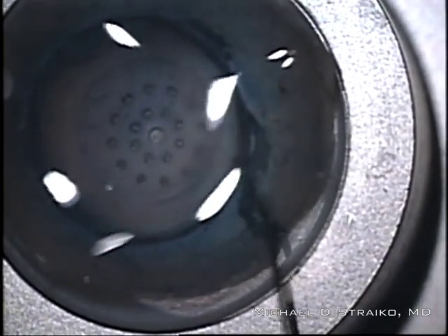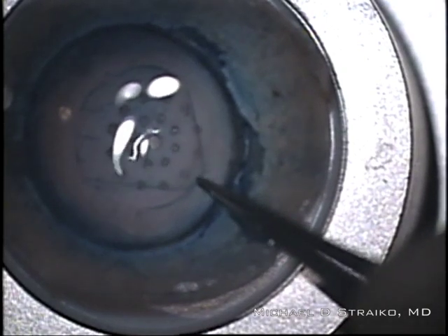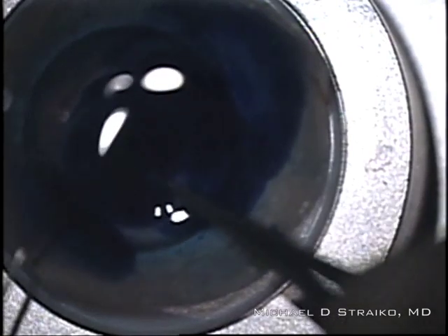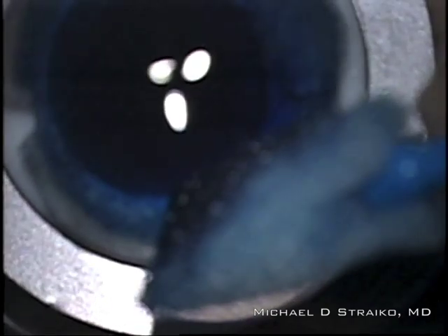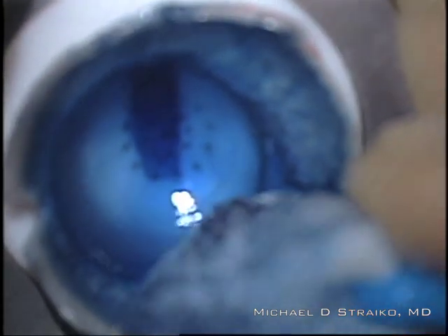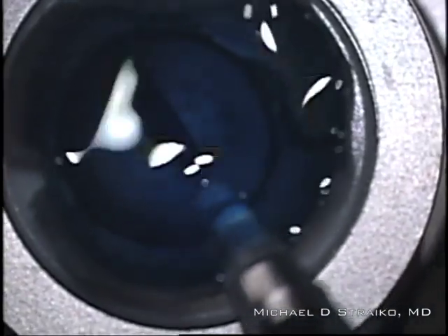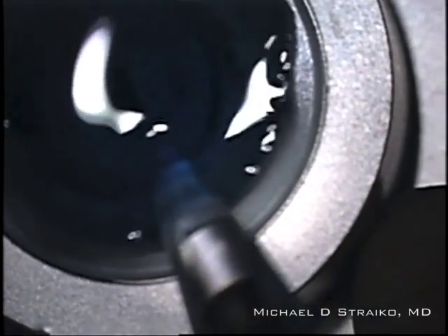I peel off the peripheral Descemet, which can be used for practice on loading the injector. Then I use balanced salt solution with gentle jets of BSS to elevate the graft. Once I have the graft nice and free, I use the tiers to grasp the graft — that's the only time I touch the graft with forceps, just that one pickup. I add Tri-Pan Blue to the well that already contains BSS and let the graft soak for about 3-4 minutes, which is sufficient to get a nice deep blue stain. Then I gently use a Merocel sponge to remove the fluid, positioning it not towards the edge of the graft but towards where the graft is pointing, making it less likely to jump to the sponge. I then float the graft in BSS and aspirate it into the modified Jones tube I developed specifically for DMEK surgery.